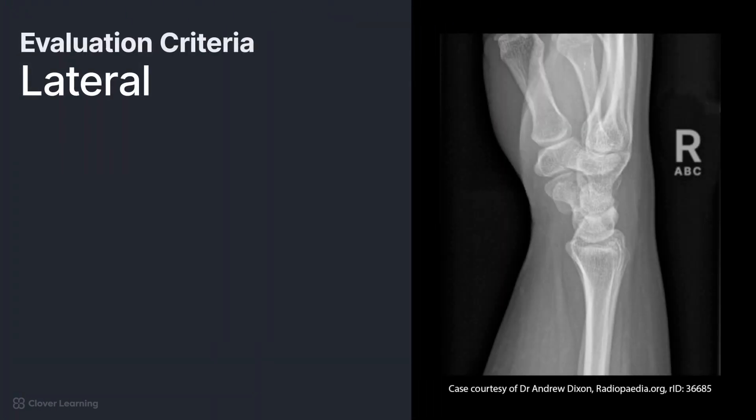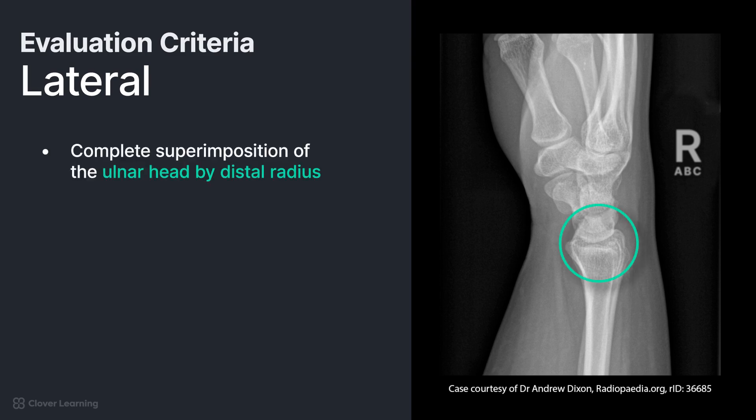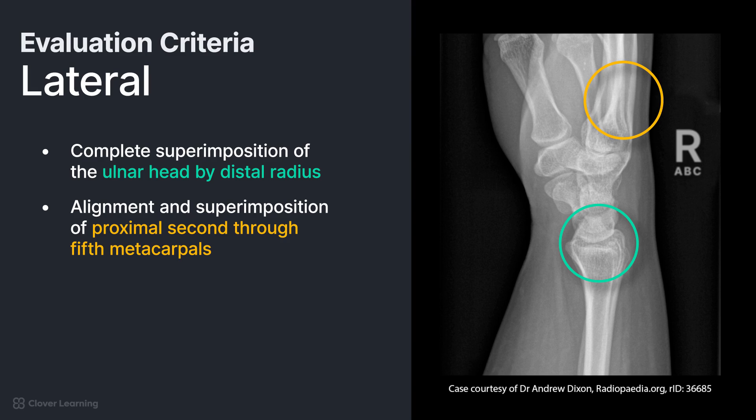The final projection in the series is the lateral. For a lateral projection of the wrist to be a true lateral, there must be complete superimposition of the ulnar head by the distal radius and alignment and superimposition of the proximal second through fifth metacarpals.